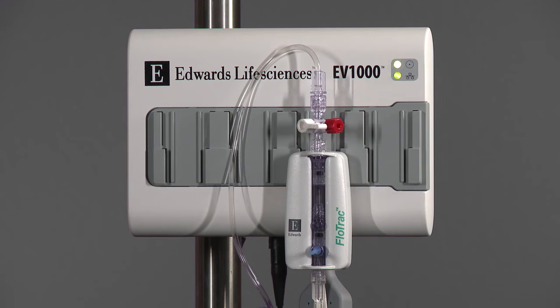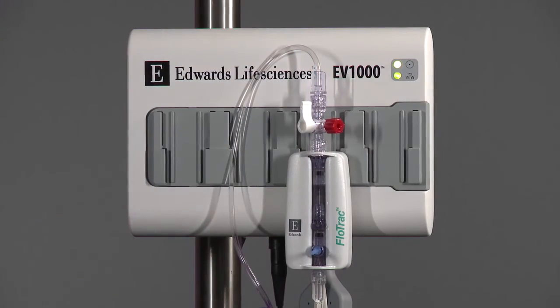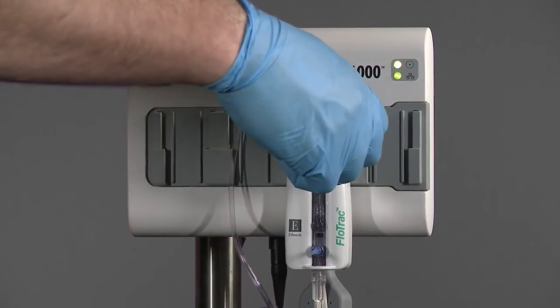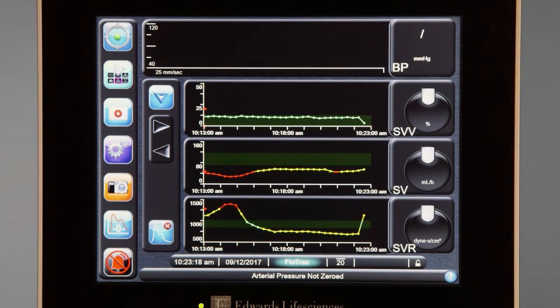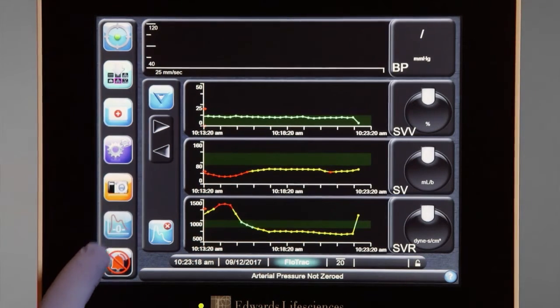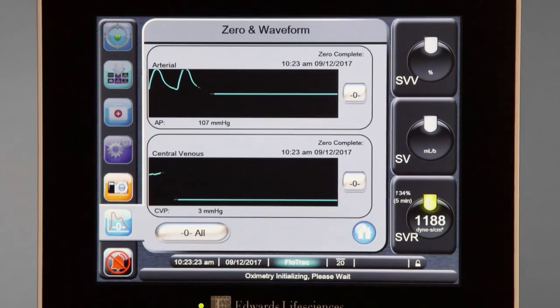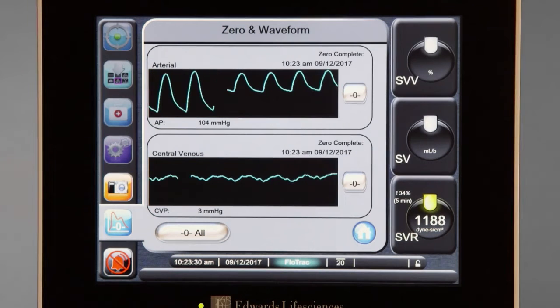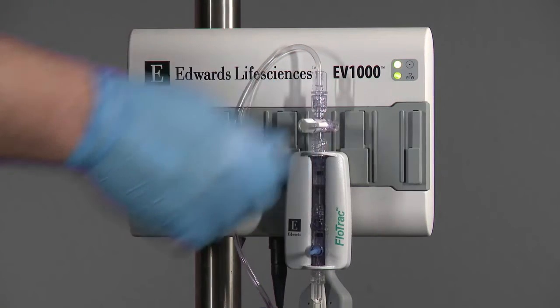Level the FlowTrack sensor to the patient's phlebostatic axis. Turn the reference stopcock of the FlowTrack sensor toward the pressure tubing and remove the non-vented cap. With the stopcock open to atmosphere, zero both the bedside monitor and the EV-1000 clinical platform. Confirm that the EV-1000 reads zero complete and the monitor reads zero millimeters mercury on the arterial channel. Turn the stopcock toward the reference port and replace the non-vented cap.